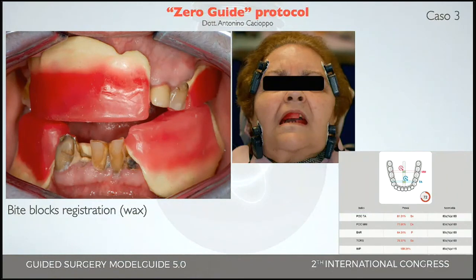But in these cases you have to think about full edentulous. Is it right to have only aesthetics as a parameter to manage, only the upper lip and lower lip, the symmetry, the medial line, the bipupillar line, or can we have more?